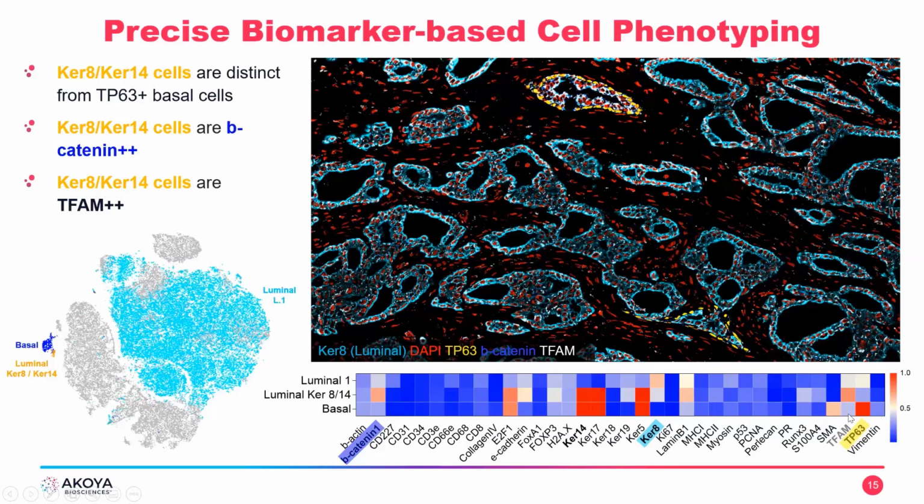So this is one of the things that I think is most exciting about CODEX. And that is this toggle between big data, or let's just say T-SNE plots, something that single cell biology is, heat maps, and actual hard anatomical data at single cell spatial resolution. All of these windows can be opened simultaneously in your software if you want, and you can toggle back and forth.